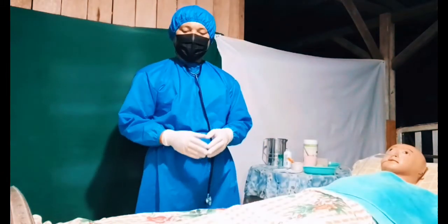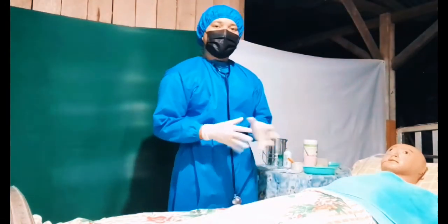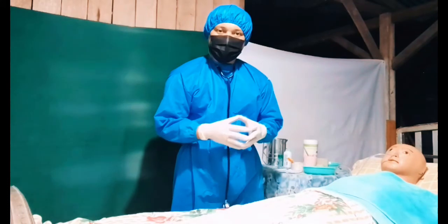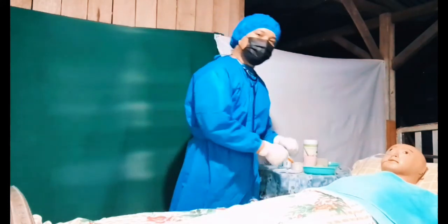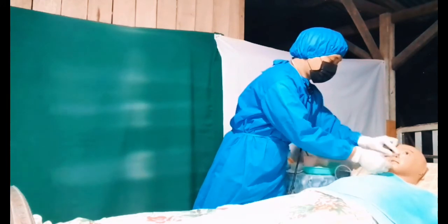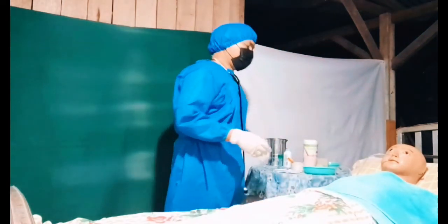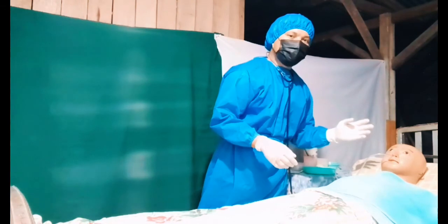Now, we'll be doing the removal. When you're doing the removal, tell the patient to hold her breath while you quickly pull the tube. But before that, remove the plaster carefully. And tell the patient to hold her breath for a count of 3. Ma'am, can you hold your breath? And 1, 2, 3.